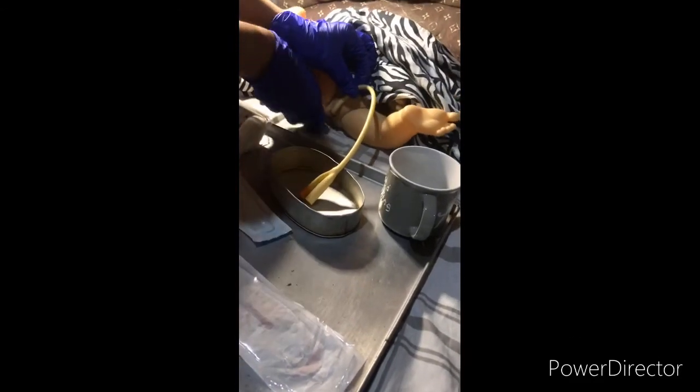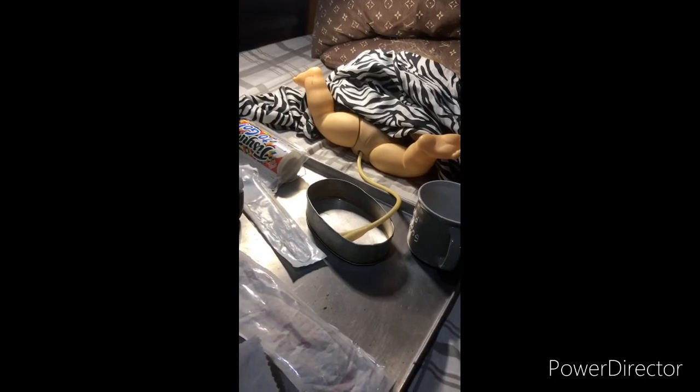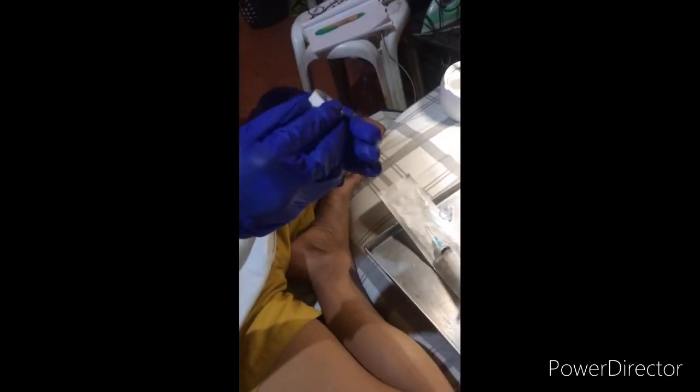Catheter positioned over the thigh prevents kinking. Non-allergic tape prevents skin breakdown. Anchoring catheter to the lower abdomen is thought to reduce pressure on urethra at junction of penis and scrotum, thus reducing possibility of tissue necrosis in this area.